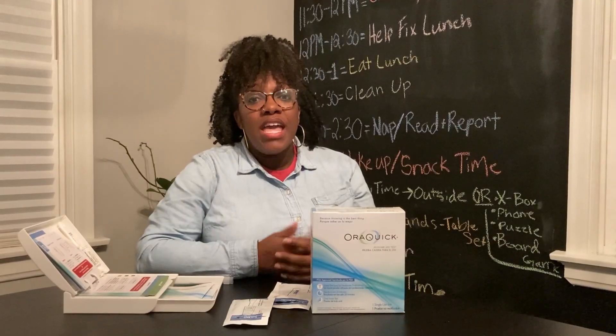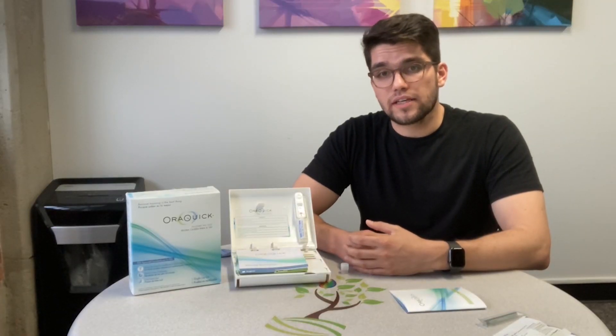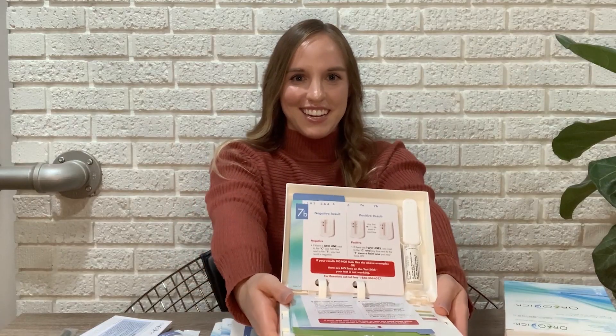The HIV rapid self-test is a great, very simple, easy way to find out your HIV status from wherever you are. If your test result is negative, explore preventive options like condoms and PrEP. And if your test result is positive, getting into care helps protect you and your partners. Get tested — together we can end the HIV epidemic.